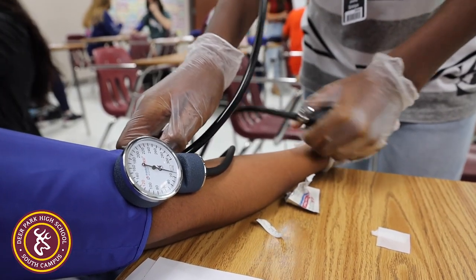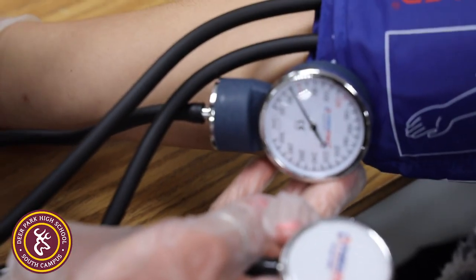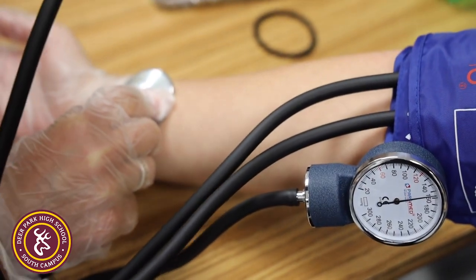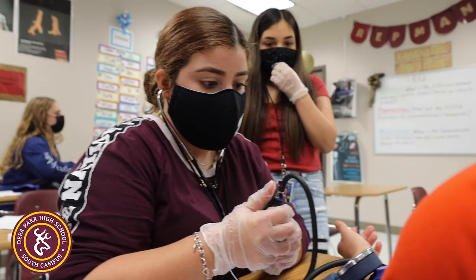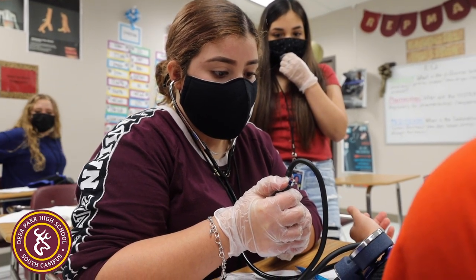Once they get the cuff on and the stethoscope in their ear, they'll place it on the brachial artery for a reading. They focus on the gauge and learn how to pump it up and release it slowly to be able to hear the pulse.